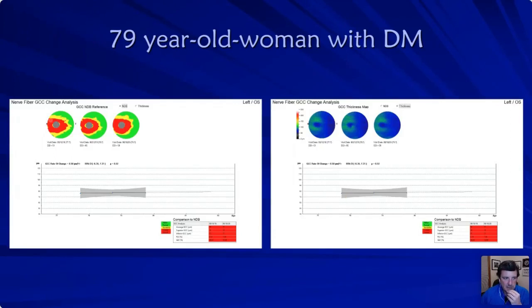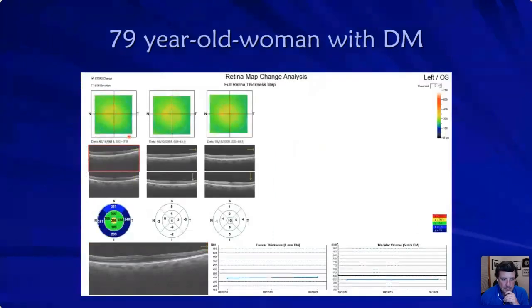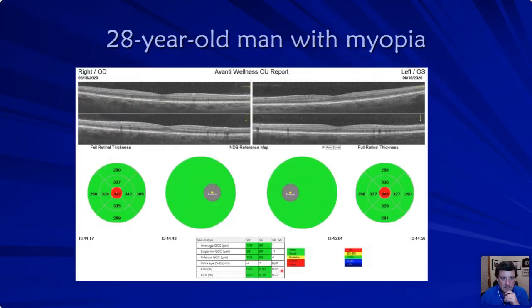But she has all this red and yellow disease. But again, that was the first scan that we started with at the very beginning. And then I just shared it again with the poll, the second poll. She was abnormally thin. She was 78 and 77 in her ganglion cell complex, but that was just totally normal for her, and she's not progressing over time. And here's just another scan just showing you again how stable things are over time.